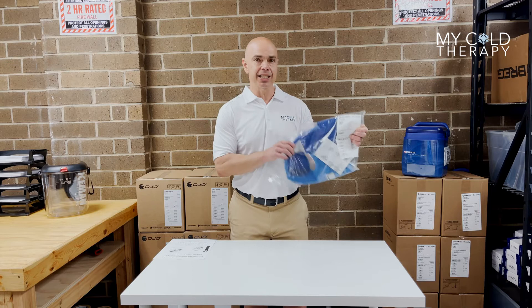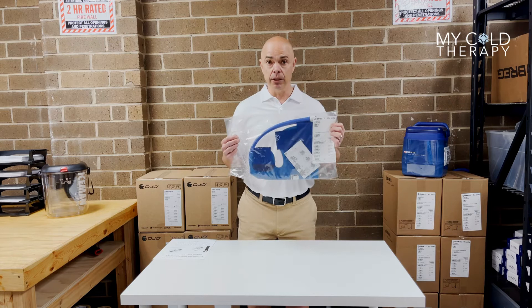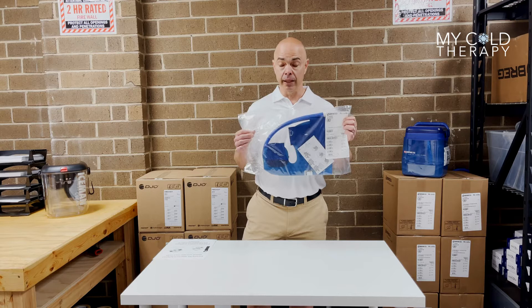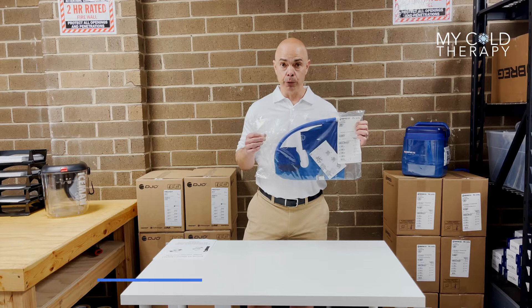These pads come sealed. This is really important. We are not allowed per our distribution agreement because most of our patients are surgery patients. These are not to be resold if they are open. So if you open the bag, unfortunately, you're not going to be able to return it. So please check that before you do anything.